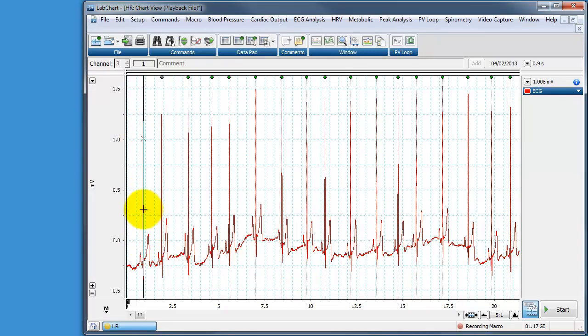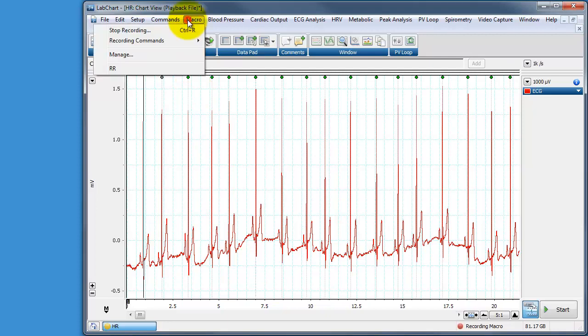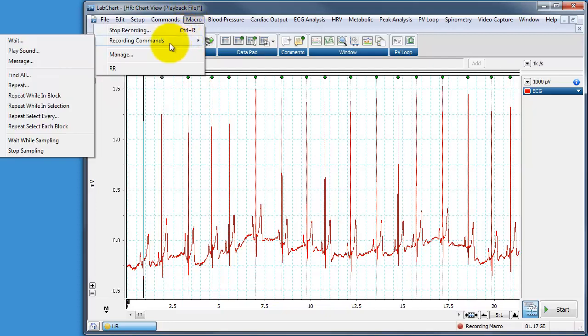We can repeat this by selecting now the data in between. Conveniently, the programming language that LabChart uses is very simple, but it gives us a few little helpers. We don't have to remember how to program a loop, for instance. We can go to the macro menu, choose recording commands and we can choose this repeat while in block.